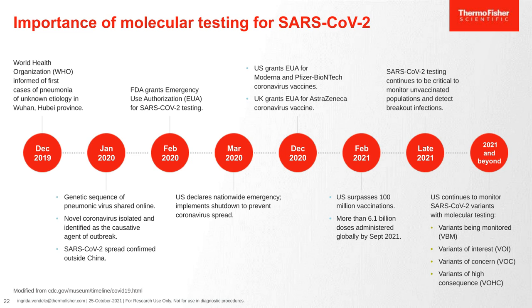In February 2020, only 3 months after the first pneumonic cases were reported, the U.S. and many other nations identified the immediate need for widely available molecular tests. Today, mass vaccination has been possible in the Americas, Europe, Australia, and many parts of Asia. However, molecular testing remains critical for unvaccinated groups, including within emerging nations, for young children for whom the vaccine is not available, and within vaccine-hesitant populations. Furthermore, with the evolution of viral variants, molecular testing provides us with epidemiological data on the incidence, distribution, and impact of vaccination on SARS-CoV-2-derived pneumonia.